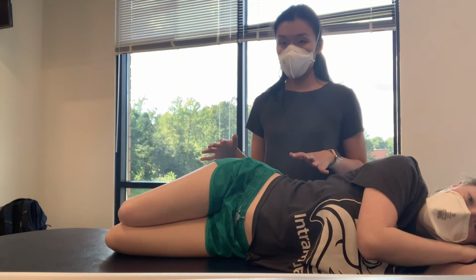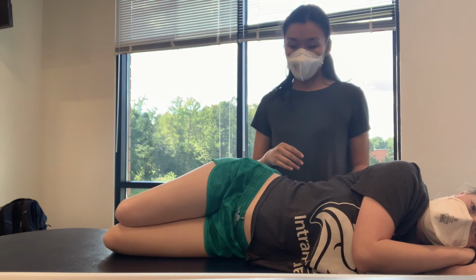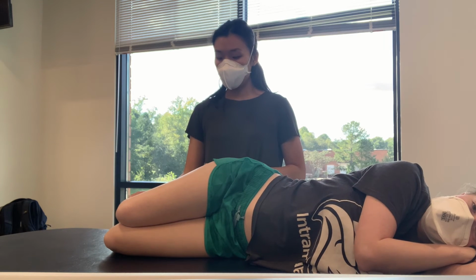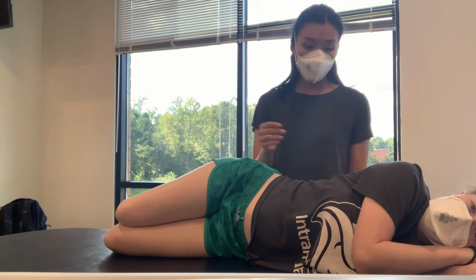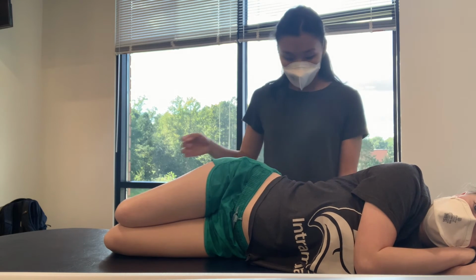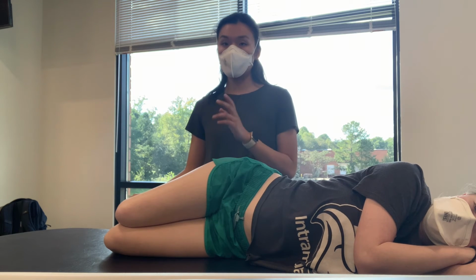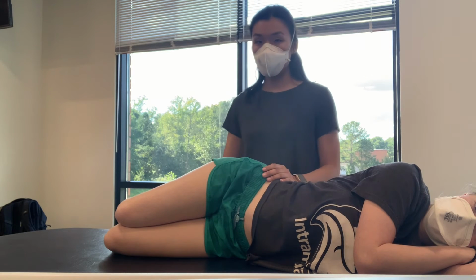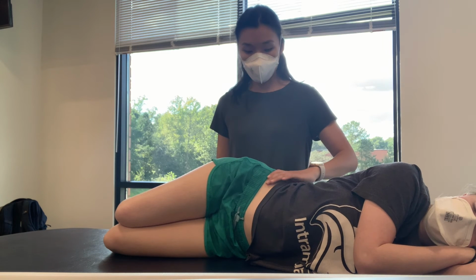Test position for hip extension. So the patient is going to be side-lying, and we're going to have her leg being tested on the top, and then we're going to have the other leg just slightly flexed underneath it. And we're going to make sure that her spine is in neutral. So she's good. And then we're also going to make sure that the hip is slightly flexed and the knee is also slightly flexed. So we want to stabilize the pelvis by palpating the ASIS and the PSIS.